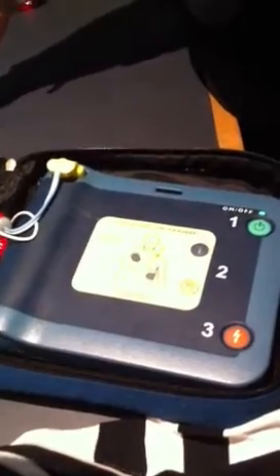Remove clothes from patient's chest. So we'll just pull up the... Okay. You've done this before, Karen. When patient's chest is bare, open grey plastic case and peel off white adhesive pads. Okay, so it's a grey box. Look carefully at the pictures on the white adhesive pads.